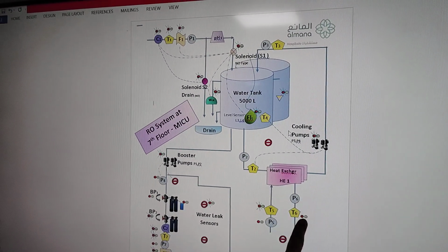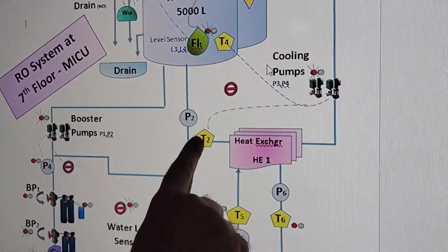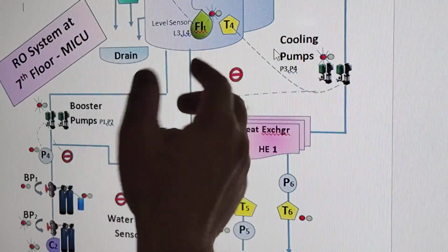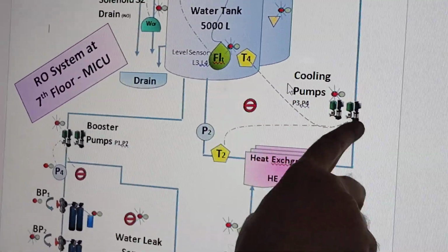The inflow and outflow, both sides we have put sensors over here. And here is a temperature sensor which will tell us the temperature of the tank. If the tank temperature is high, the pumps will be on.